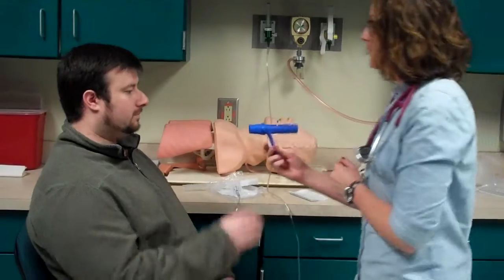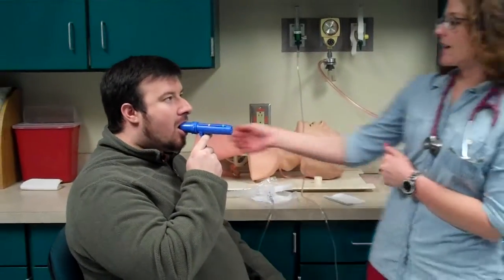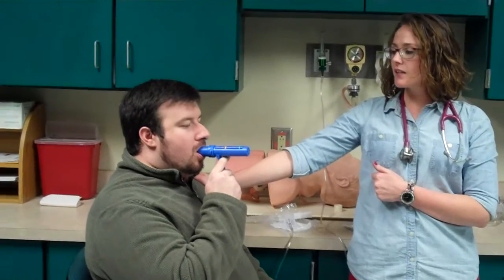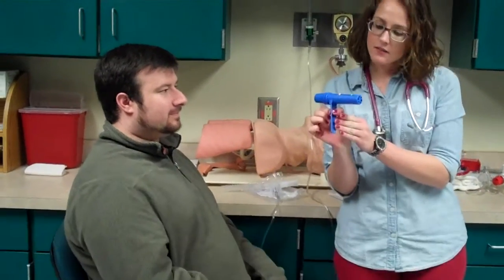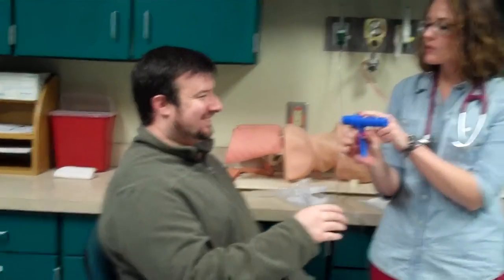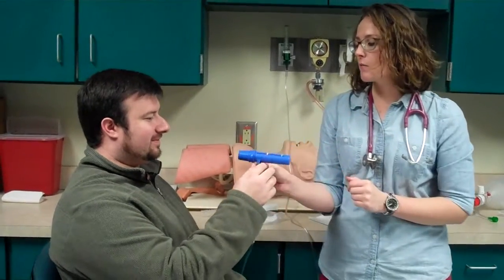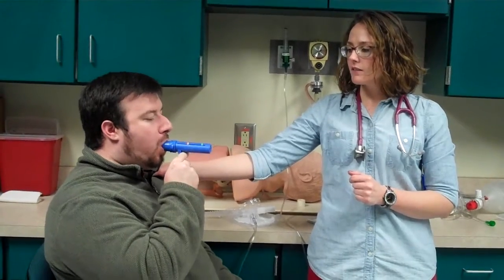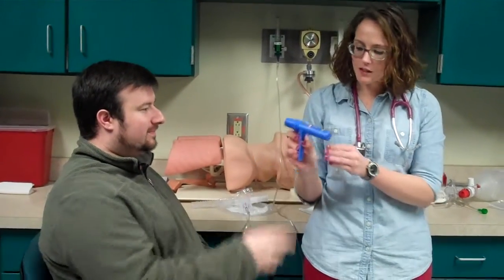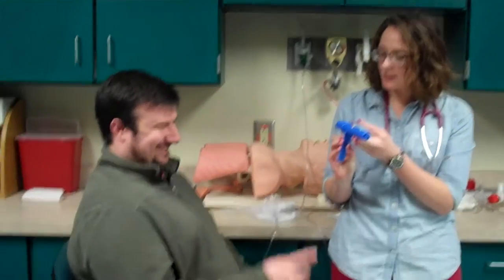All right. Oh, this looks like fun. All right, and take a deep breath in and blow out. All right. Baby, you can blow better than that. We got about 440. I think you can do better. Let's try to put it a little further in your mouth and bite down a little harder, and that might help better. So take a deep breath in and blow out. There you go. That's the better way. That's a chip off the old block. There you go, 540. I think you can do a little better.